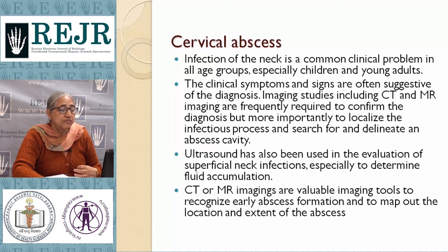Ultrasound has also been found to be useful in the evaluation of superficial neck infections, especially to determine fluid accumulation. CT or MR images are valuable imaging tools to recognize early abscess formation and to map out the location and extent of the abscess.